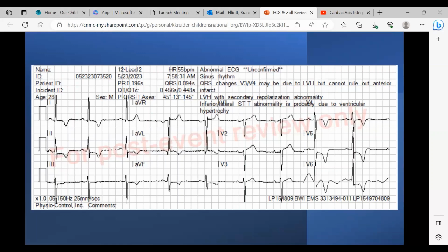But it seems wonky. Still wonky. So just specifically, when your axis is off, you'll see it through the whole entire EKG. What I would like to highlight is when it's off everywhere.